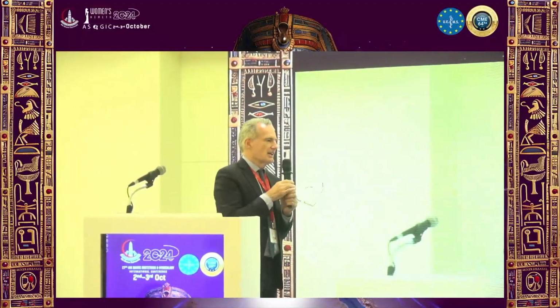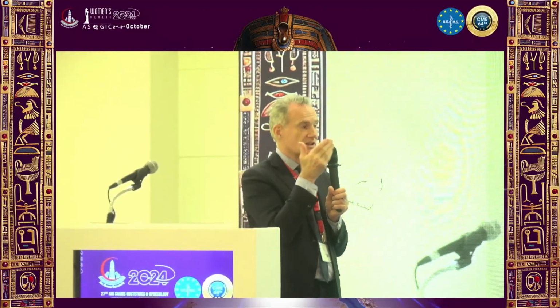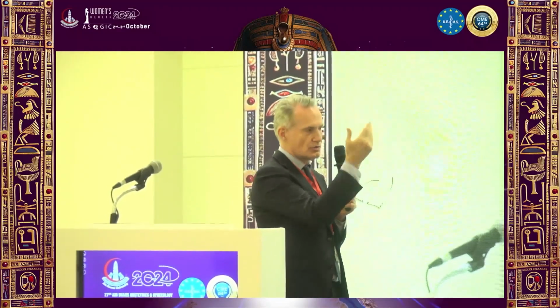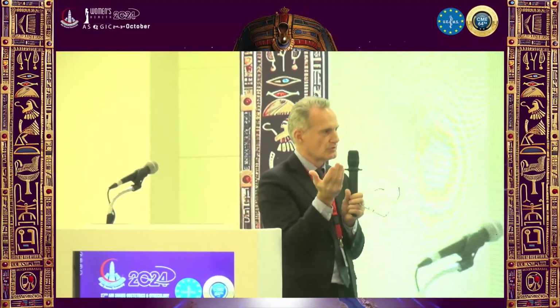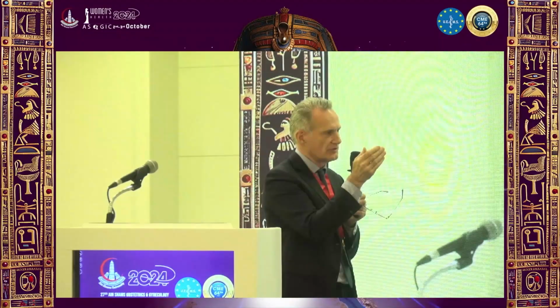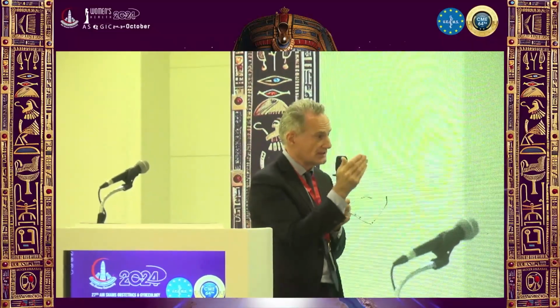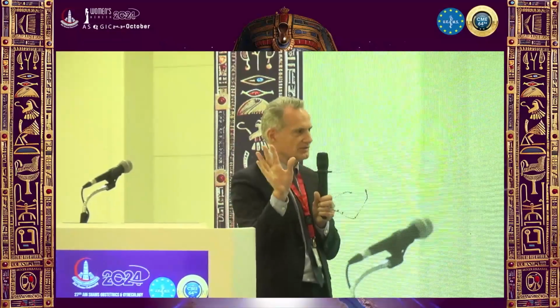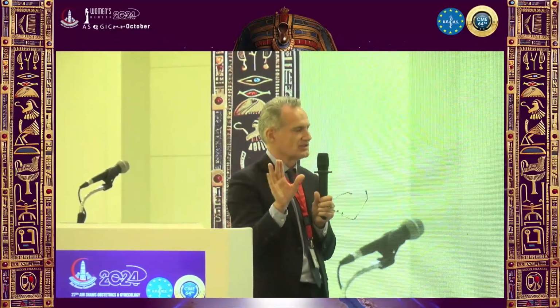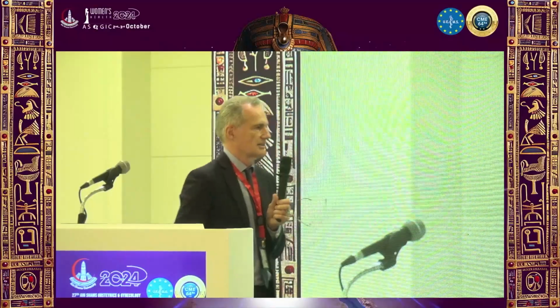But I think if you want to take your biopsies, you can take them also in the visual field you have before you. I don't think you have to go in contact. There are some papers now about contact hysteroscopy, but they are all in experimental phases. It's not that I can give you a concrete advice for that.